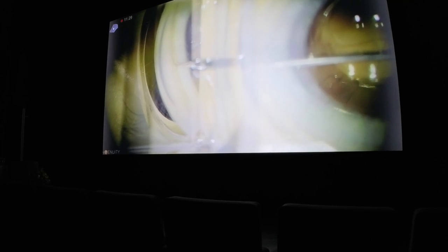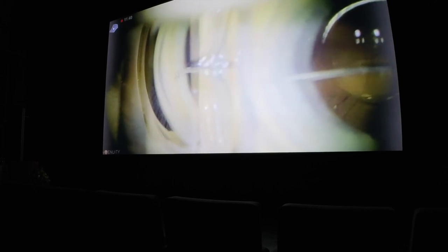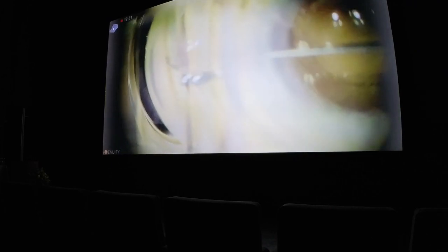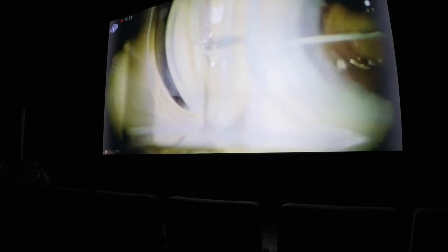This is an example of Tanito micro-hook goniotomy. The image is through a Mori goniolens. This is important because nowadays our focus on the angle is increasing — there are devices like iStent, recently acquired Hydrus from Alcon, and there was Cypass in the past. The angle is a new — or old, newly rediscovered — target for glaucoma specialists.